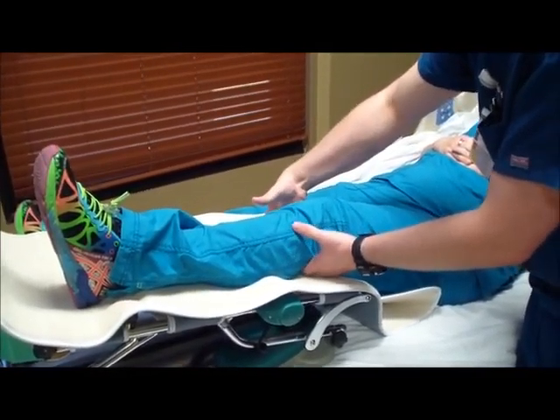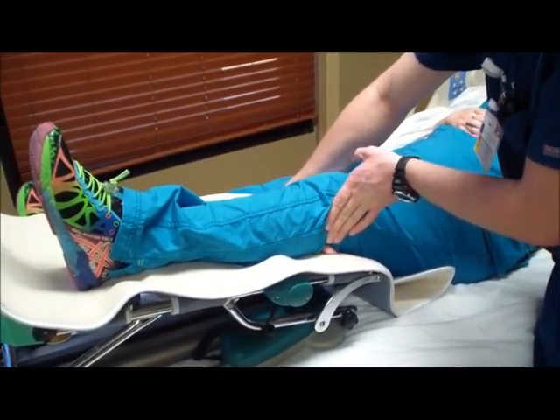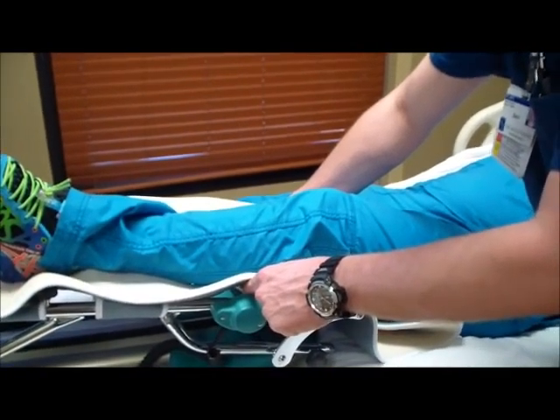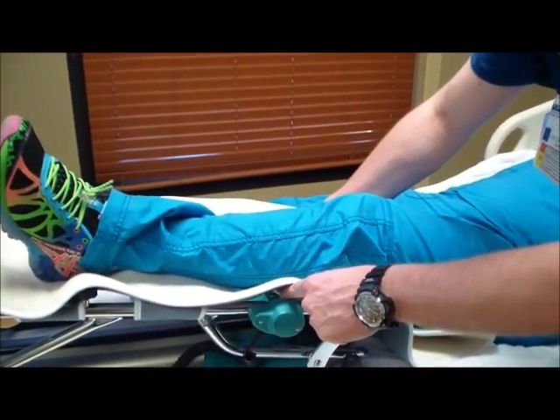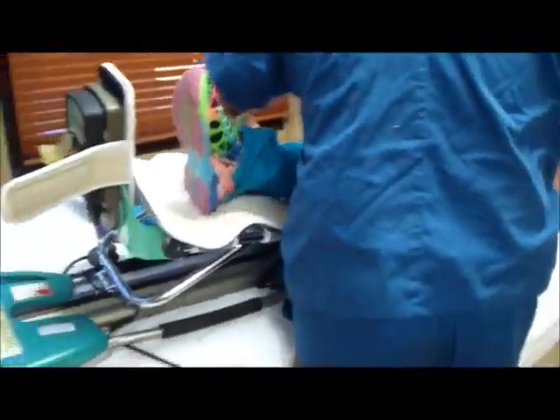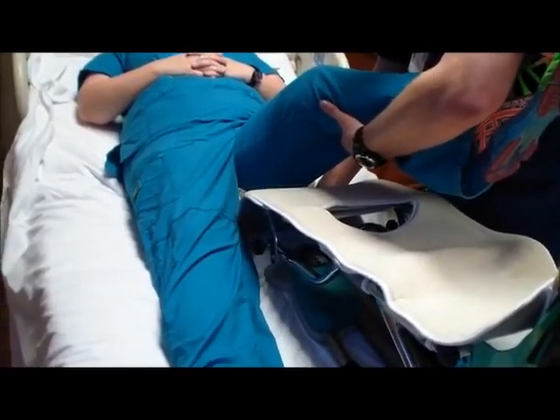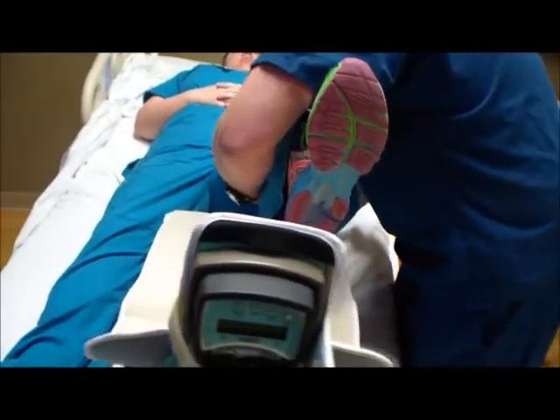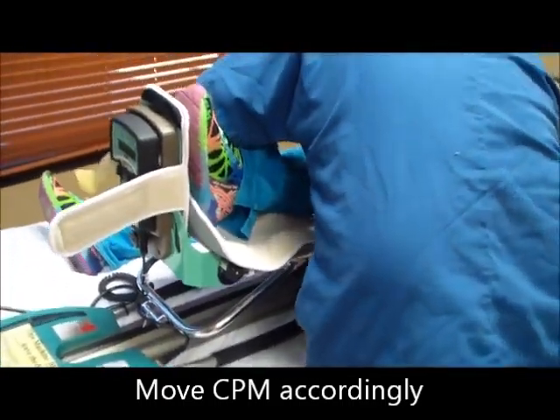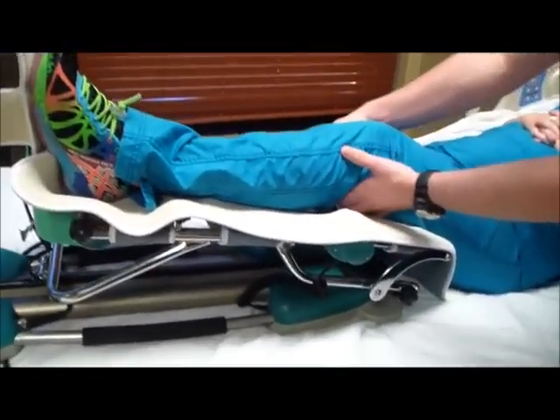So I can even use my hand underneath, or you can use somebody else to help you out. I'm going to notice where their joint is as compared to the joint of the machine. So with this, I need to move her leg up about 6, 7, 8 inches or so. All I'm going to do is lift up, and I'm going to keep this front top part down up here. Make sure it's underneath the patient. We're going to scoot it up, and we're going to reassess, see where we're at.